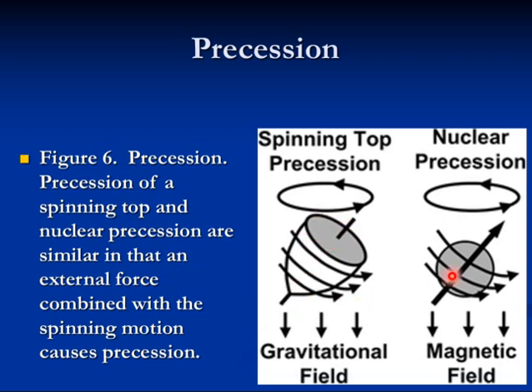The same thing with the protons. They move in an oblique direction in a certain frequency. This frequency is the frequency that we use in resonance, the resonance frequency that controls the whole thing here. We just make the head of the department come, and everyone will be good. So the head of the department is the resonance. Okay, don't tell him that.